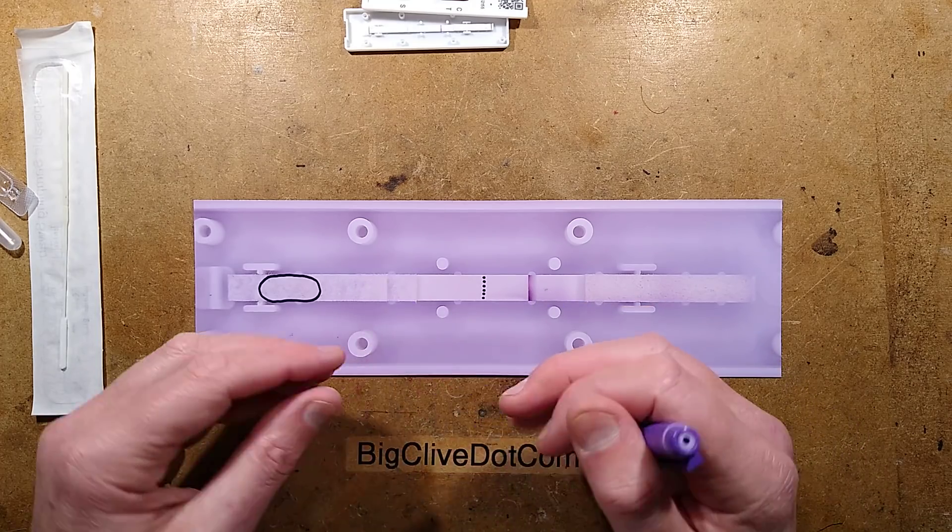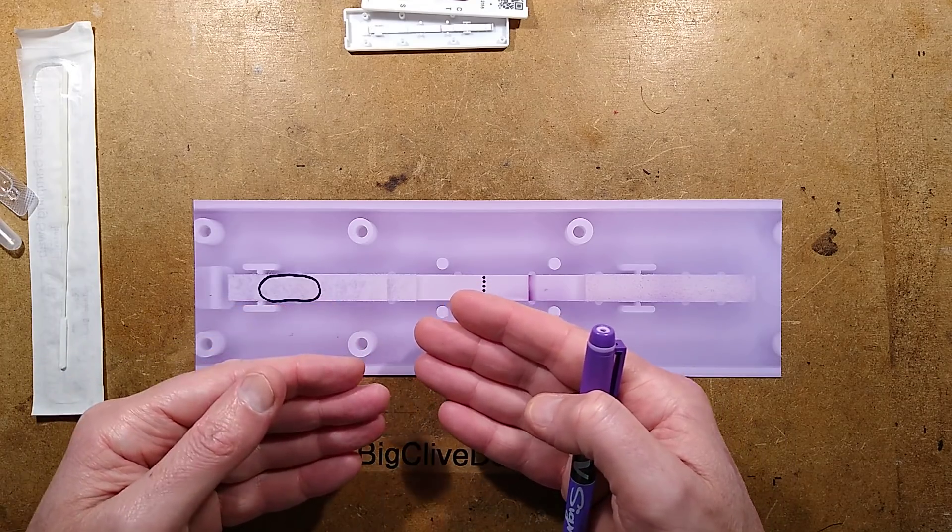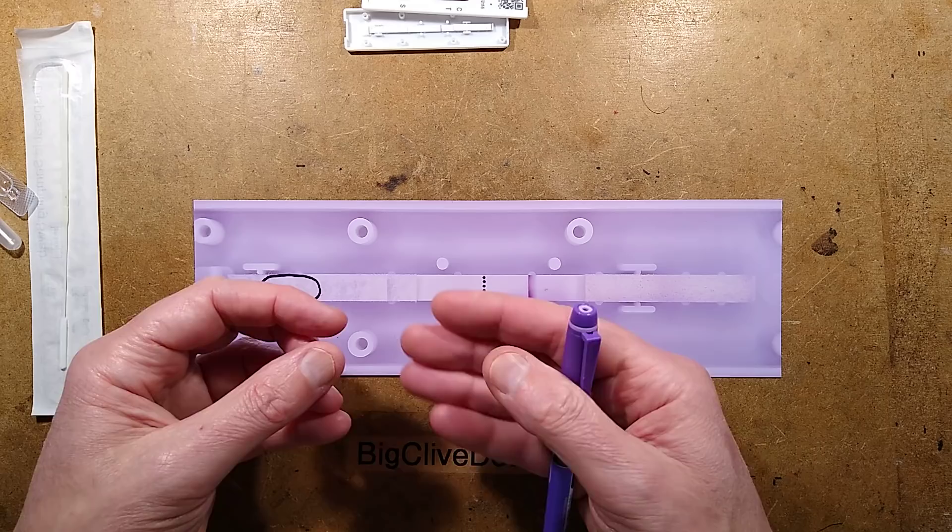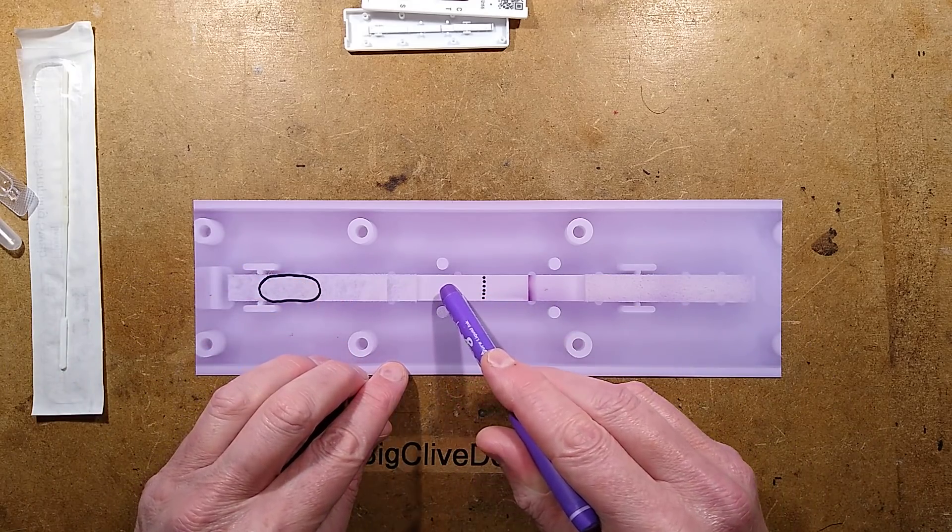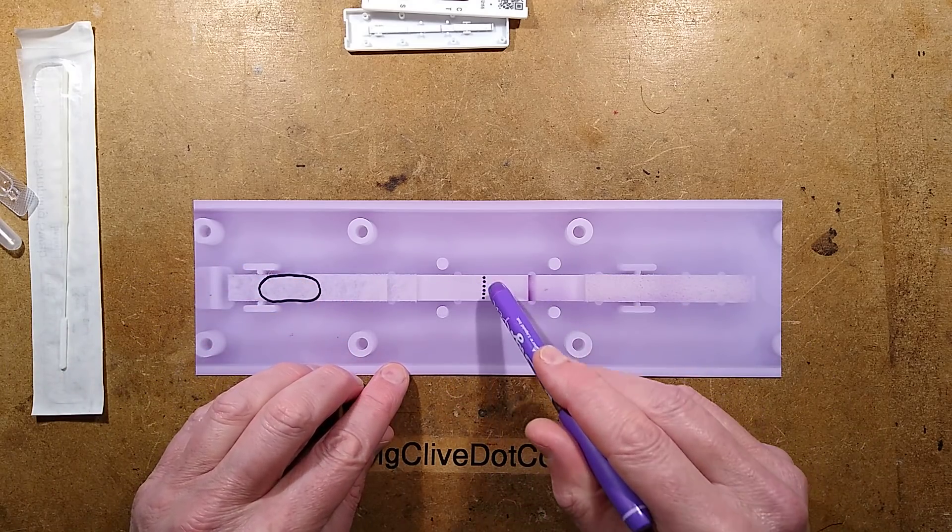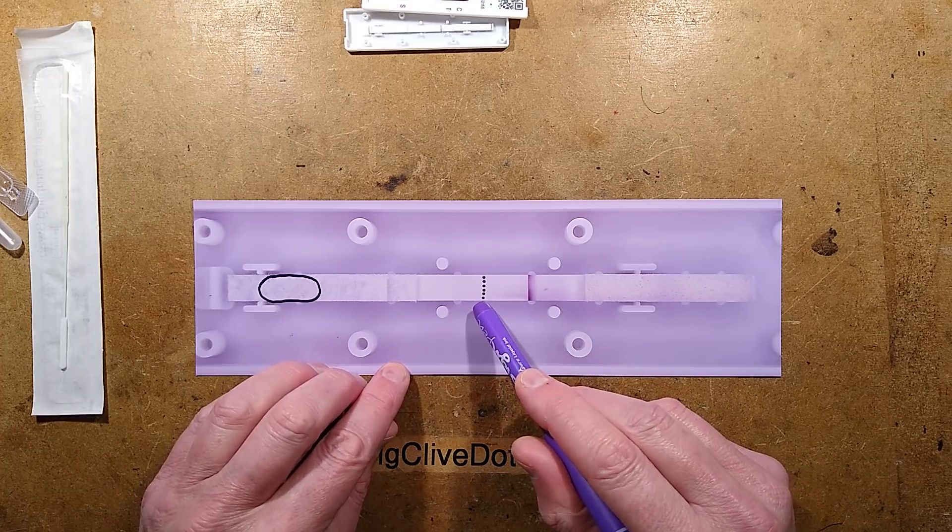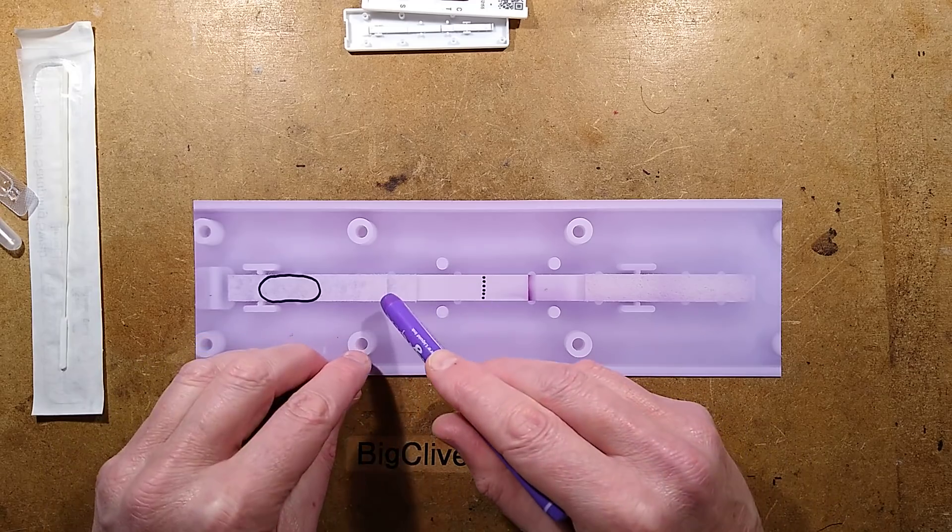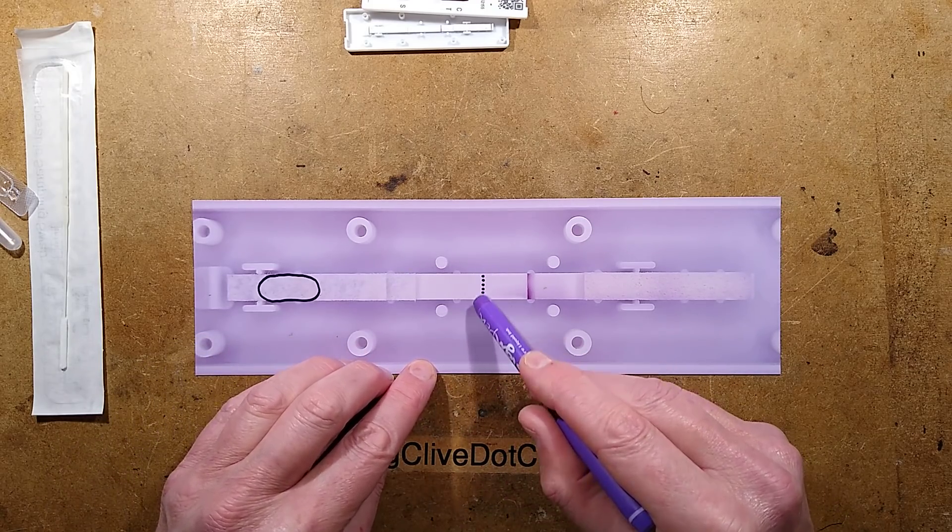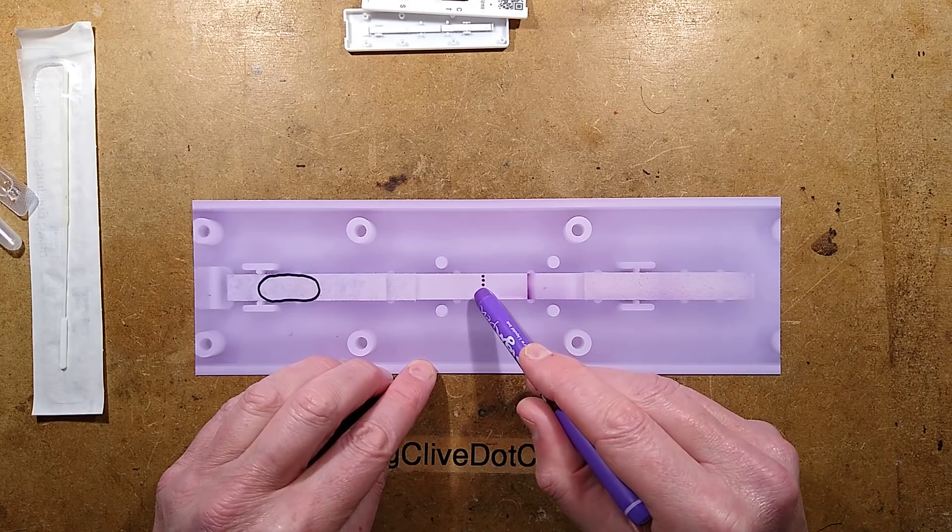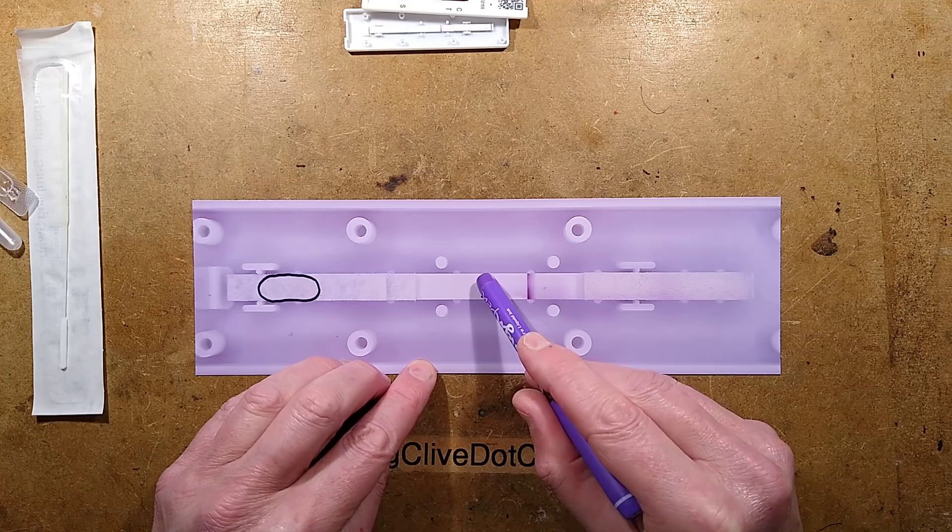So as it passes through, if there are virus particles, it latches onto them with that marker dye. It then continues up through two areas which have molecular keys. The first area is the test area. And if the molecules do have the virus, then the virus is trapped onto these little test keys and it makes the dye visible at that point. It causes a concentration of the dye.